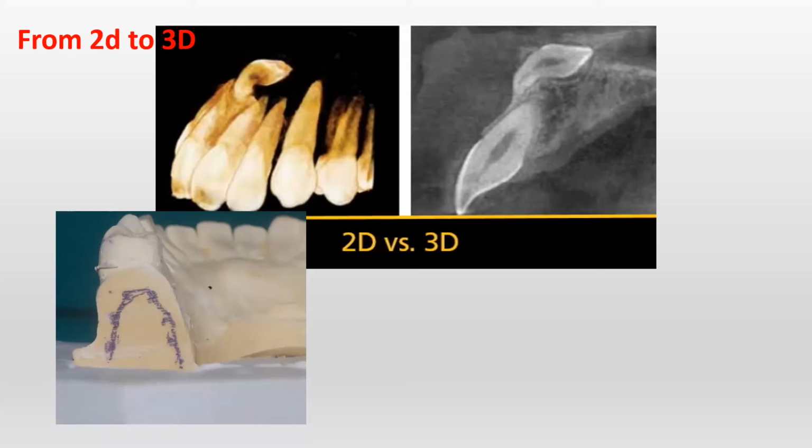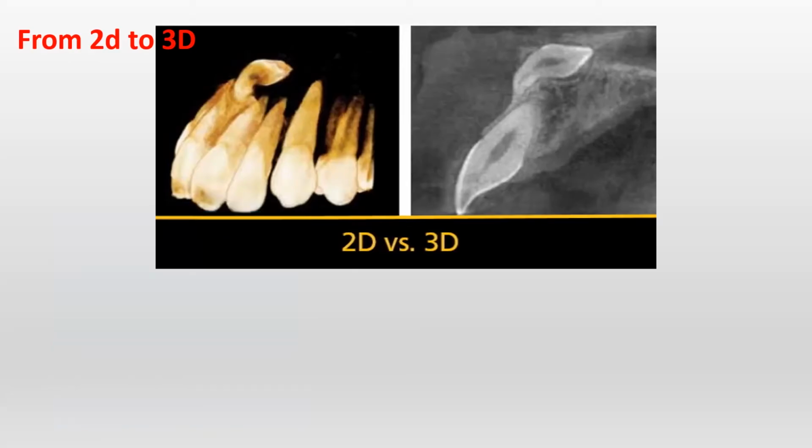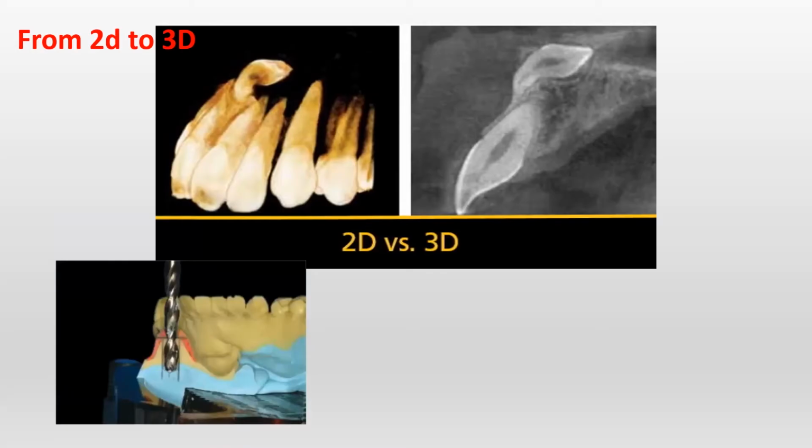In this method, we are basically assessing the width of the bone and measuring the soft tissue thickness at different points across the ridge, and transferring it onto the sectioned cast in the edentulous area where the implant site is proposed. Based on this assessment, the diameter of the implant used to be selected, and this is how the implant was planned. This is the final drill of the implant which used to be assessed. Based on this, arbitrarily, not exactly, the diameter would be fixed, because some amount of variation would definitely be there as it is all based on measurements.